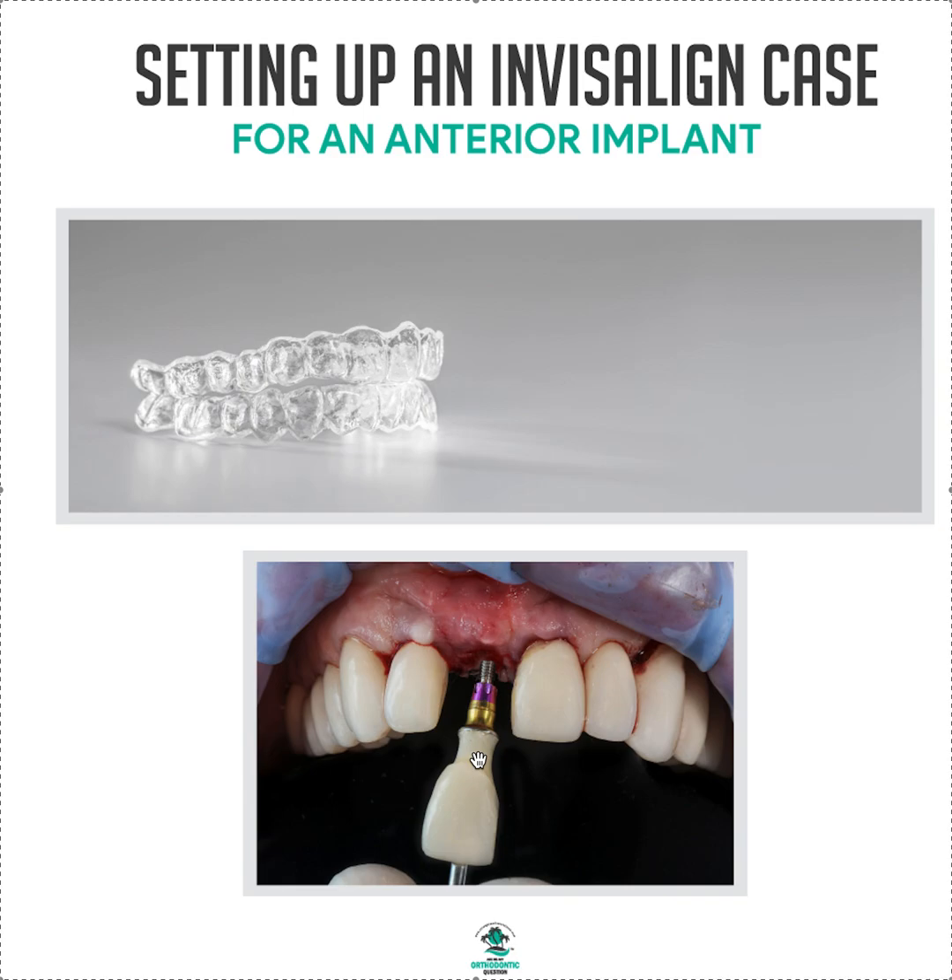You definitely want to be loading the implant correctly — the opposing tooth cannot be in contact. You have to have enough clearance both vertically and in an AP direction. Always make these cases Invisalign Comprehensive so we can do it right, or ClearCorrect Unlimited. Hopefully that was helpful — thank you!